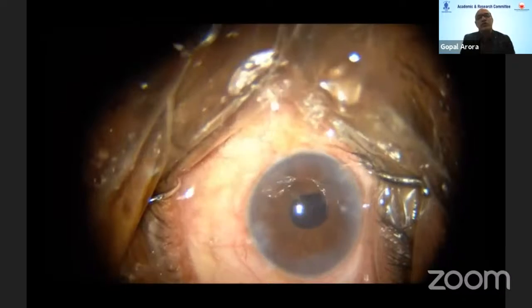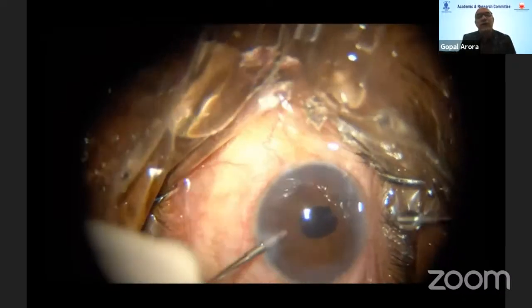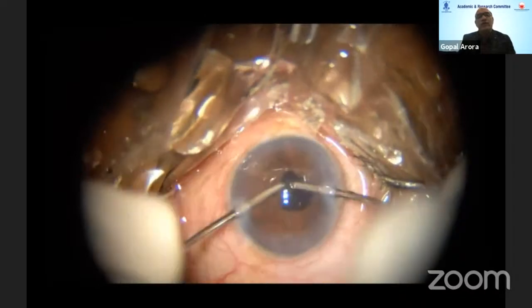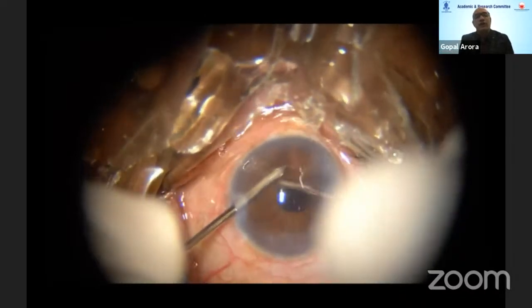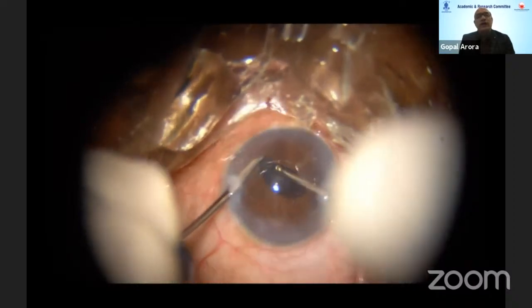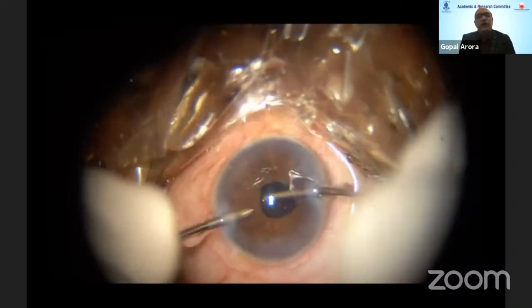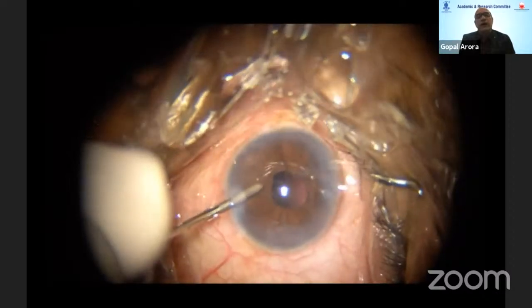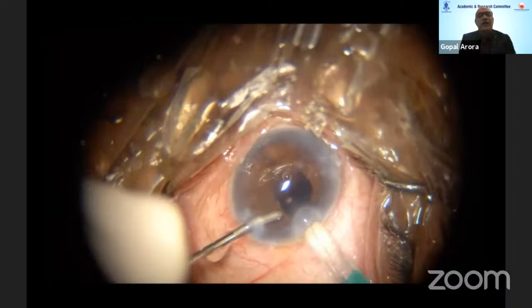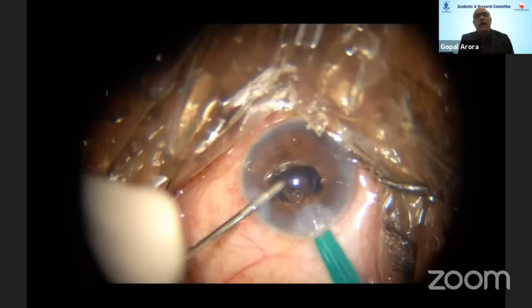I'm more used to doing a hydroimplantation of the lens. So normally I don't use a viscoelastic when I'm loading the intraocular lens. So it's just after you have taken out the entire cortical matter, you can simply do the implantation of the lens, which I don't use viscoelastic. So that basically takes you to the end of the surgery.